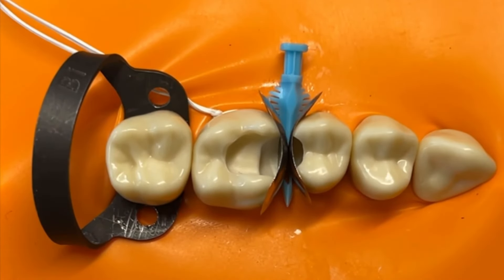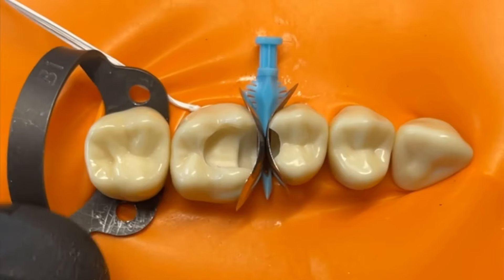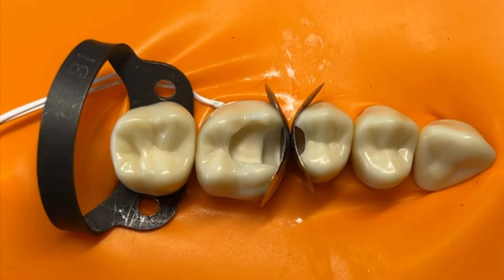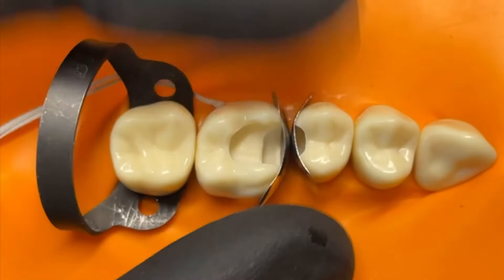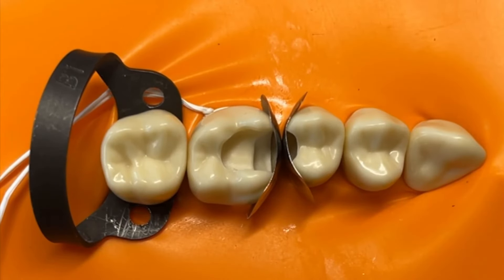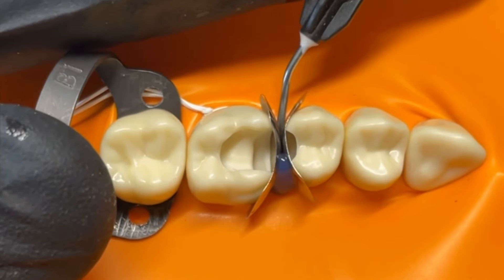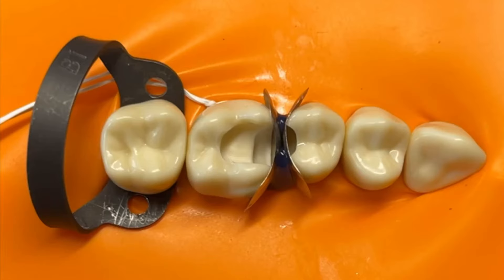The other reason we don't need a separating ring is we're just going to fill one cavity at a time, so we don't actually need the separation the ring provides. In fact, we don't really need the separation of the wedge either — as long as we feel we can get enough cervical seal, we could restore these without a wedge. That's helpful when the cavity is quite deep and near the papilla and you can't easily place a wedge without creating distortion. Doing them one at a time also gives you a good chance to finish that cavity very easily.